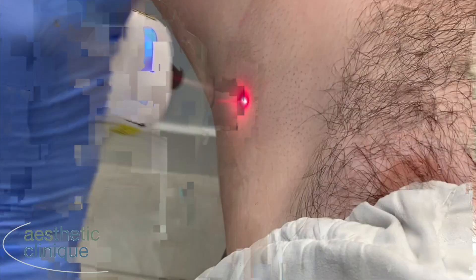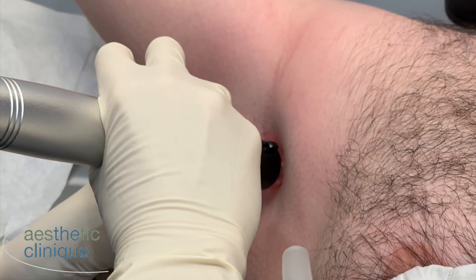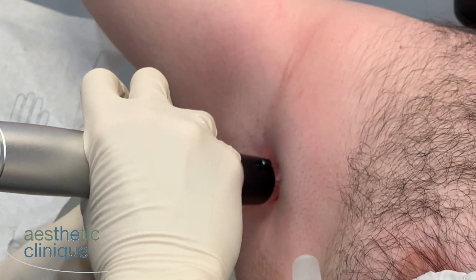Right now we're starting the Genius for the hyperhidrosis. In the lower corner, you'll see the Zimmer just as a distraction.